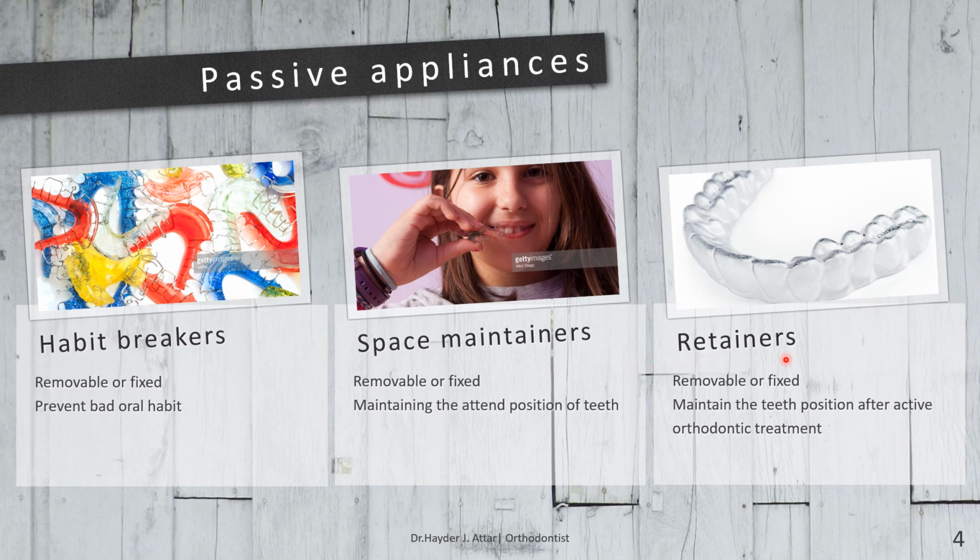The retainers are also removable or fixed appliances used to retain the teeth after the active orthodontic movement or at the end of the active movement of the teeth.